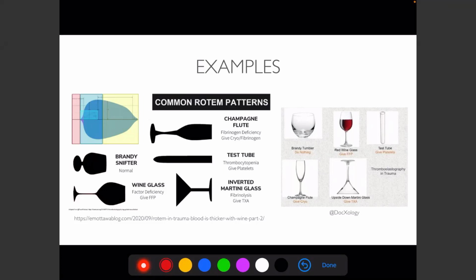And for us as a training program, we've started to see things like thromboelastography examples bleeding into large question banks, board review. I just think it's something that you didn't hold the intensivists accountable for 5 or 6 years ago. Right. And even for people who I know who went to other institutions and trained who used it regularly, oftentimes resuscitation was guided by a pathology fellow or a pathologist looking at the Rotem. This is something, to Lars's point, I think just like a lot of the things that we do now, will be quickly adopted by intensivists and probably instituted without any new mind-blowing randomized control trial.